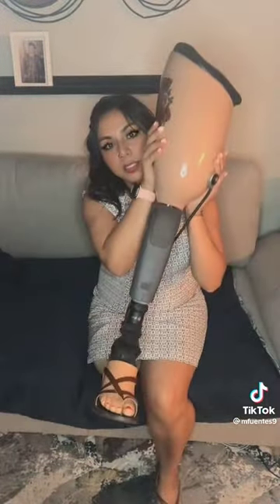Hi guys, so today I'm going to show you how I take my prosthetic leg off. Excuse my face being up here. I have to press this valve that lets the air out. And here is my leg.